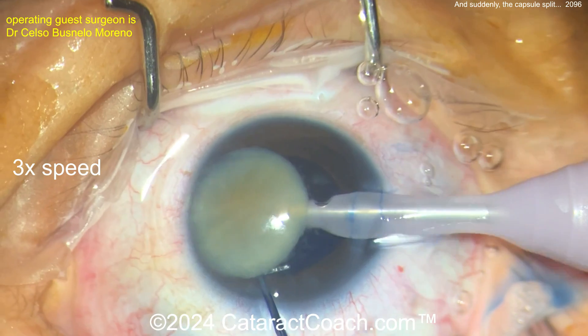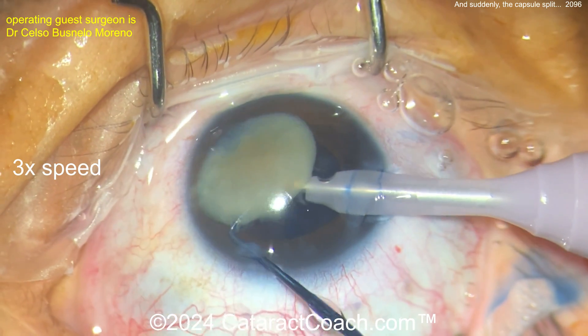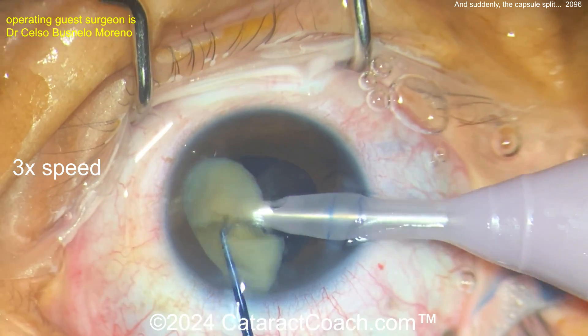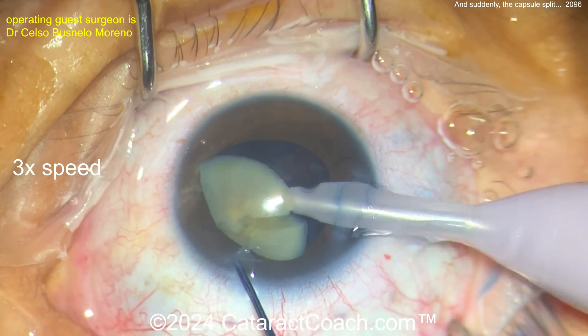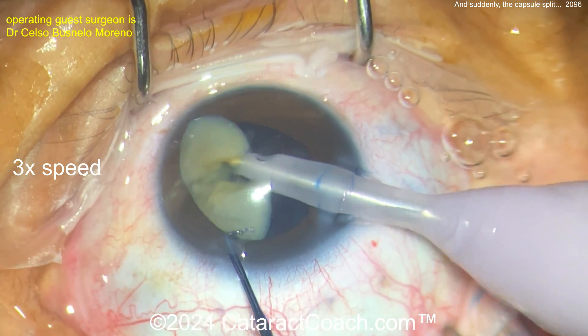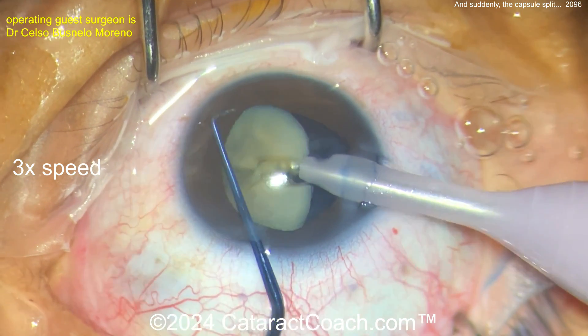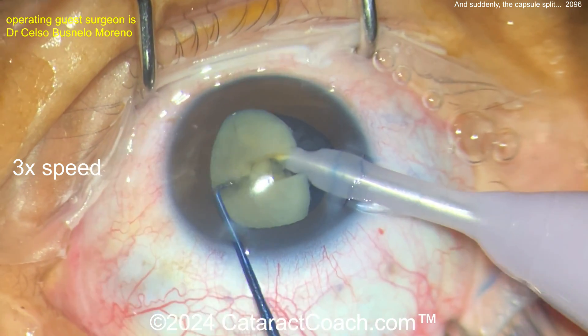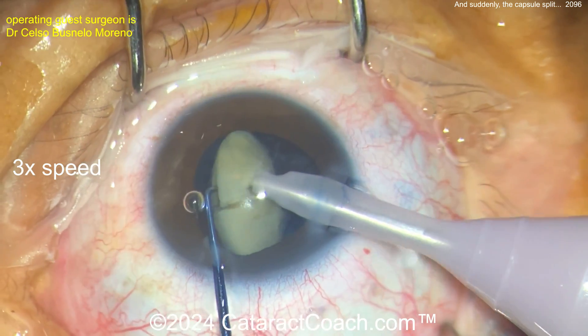Buzzing into the nucleus. You could also convert to SICS here — the nucleus is not that huge, you could probably make a relatively small SICS incision. If you are going to do chop, don't chop into too many pieces, maybe just a couple. The reason is: what if there is a split or break in the posterior capsule and you have eight or ten pieces of nucleus? Well, likely one's going to fall back. So keep the pieces all together, up in the anterior chamber.